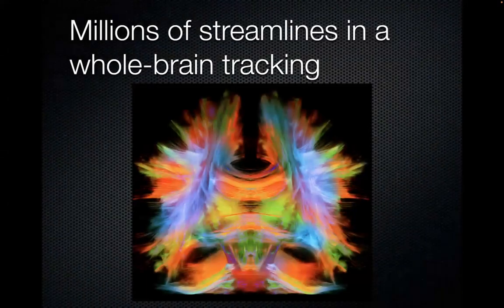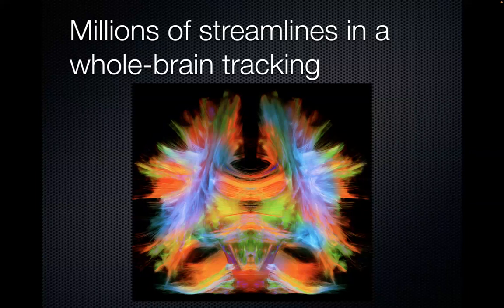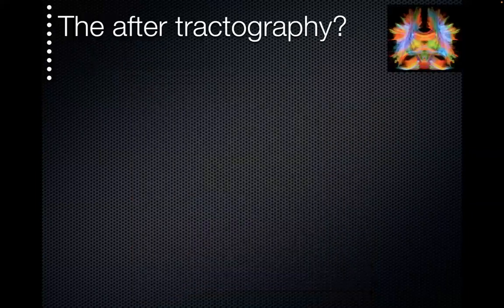Lots of tools produce this tractogram and they say, okay, bye, we're done. Good luck. What do I do with this? You know, 10 gigabytes of lines in a TRK file, a track file. What can I do with this? Two applications in my mind. One is tractometry, trying to quantify tracks. And the other is connectivity, connectomics.